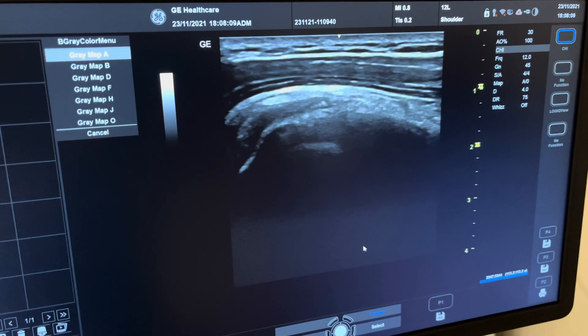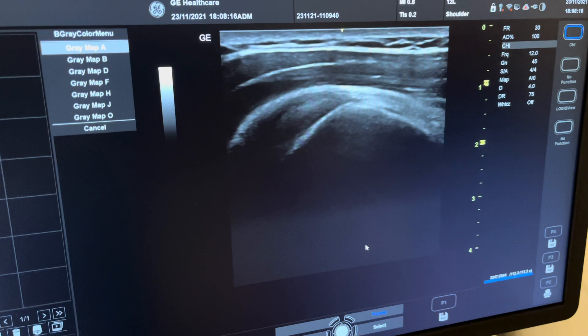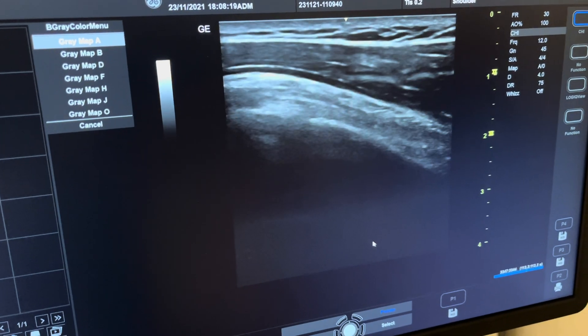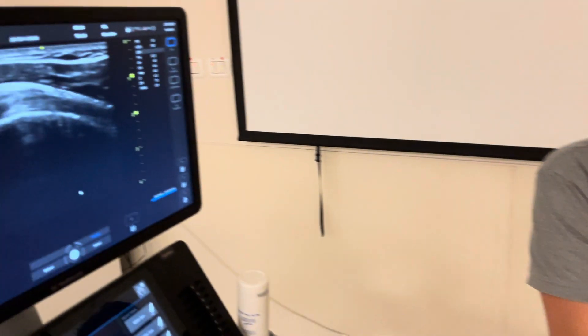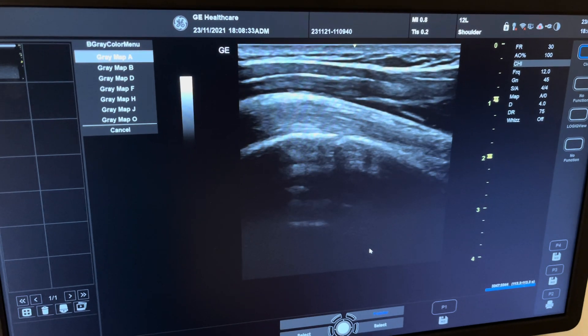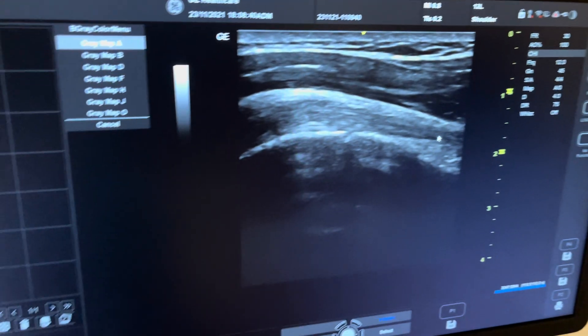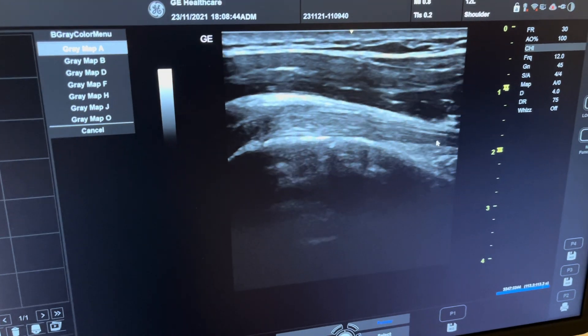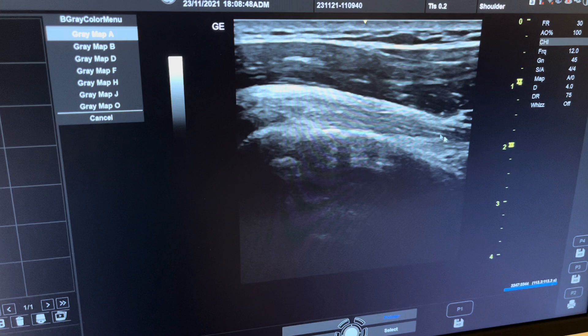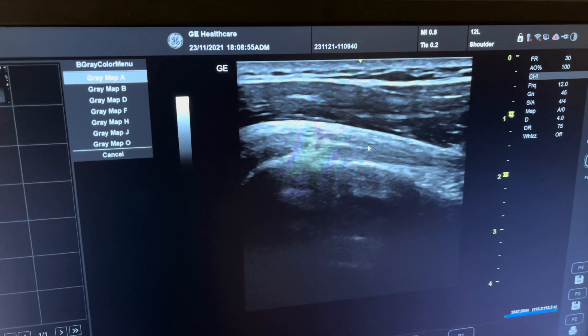Moving the probe laterally, the pointy mountain disappears, becomes a valley, and the tendon appears in the groove. Moving further lateral, you see a flat mountain — that is the greater tuberosity. Those are the two landmarks. Going in between them puts you in the right position. On the image, you can see the fibrillar bundles inside the biceps tendon, but distally they appear hypoechoic — due to anisotropy.